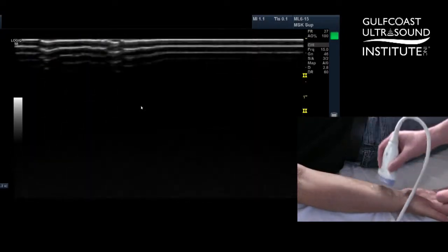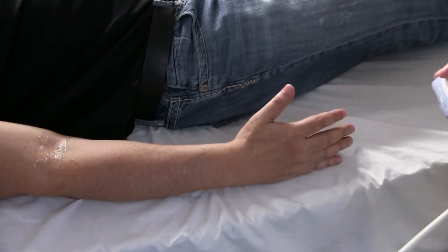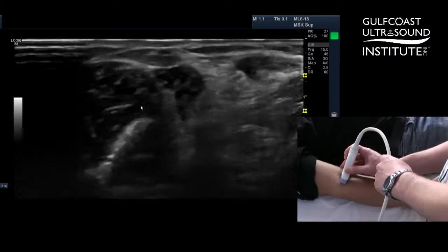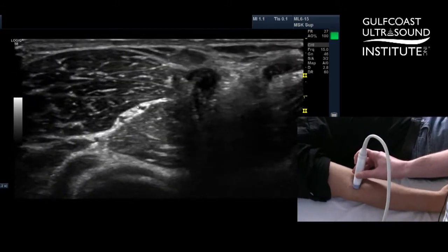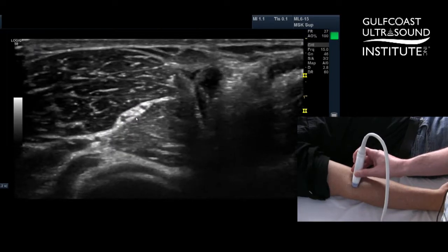To come up and block the radial nerve, it splits distal to the elbow. So you want to have your patient turn their hand a little bit more thumb up. Then you can put the probe right here in the middle of their arm and start to slide out lateral. As you tilt the probe, the nerve comes up really easily right between the two muscle layers where you can see the fascicles — a great way to block the radial nerve.